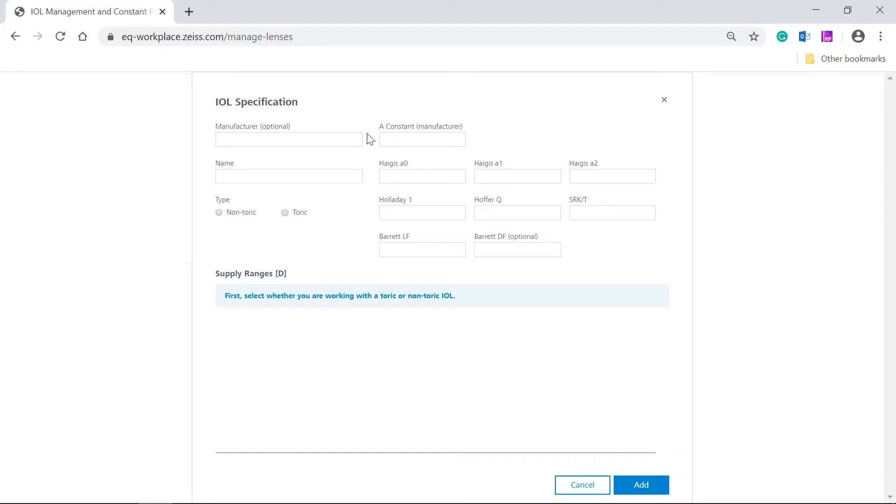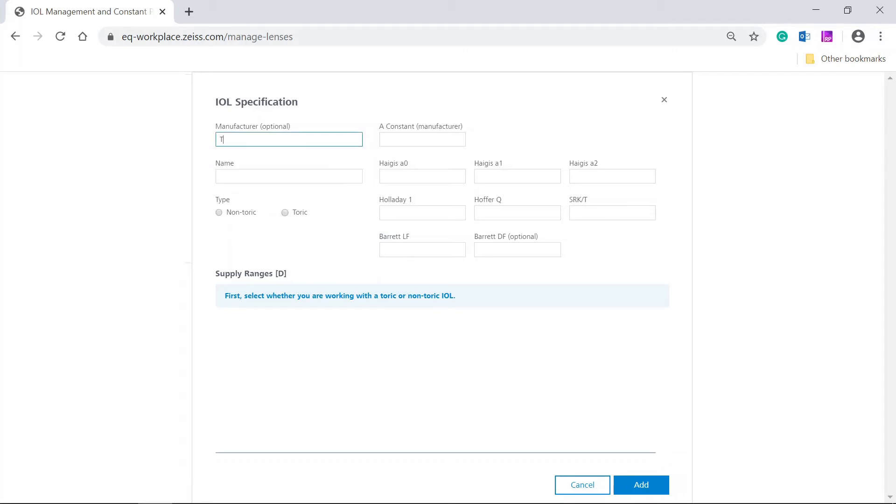Let's create a new TORIC IOL. First, enter the manufacturer name, Test, and the name of the IOL. Enter the IOL constants for the different calculation formulas.